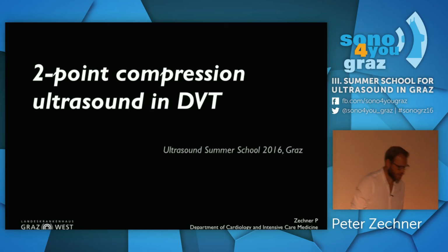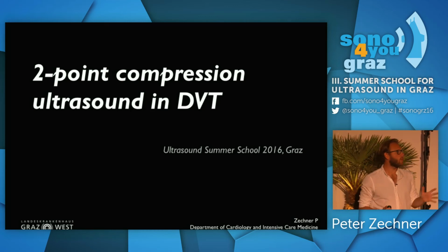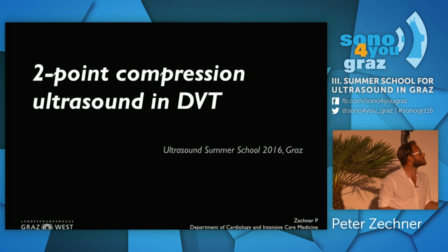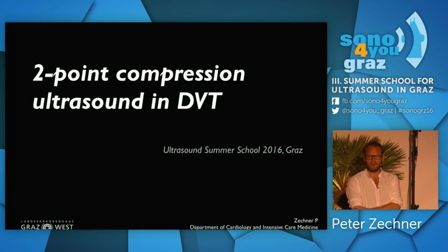So we are almost done, that's good. Now, just a few slides on 2-point compression ultrasound in patients with deep venous thrombosis.